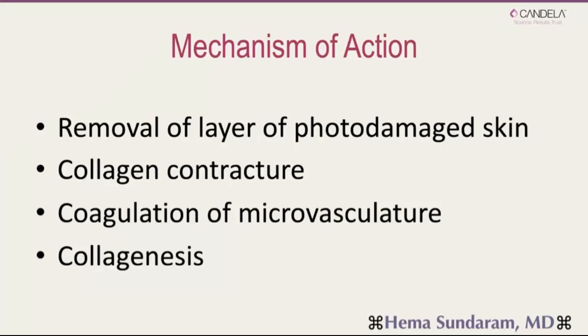during this procedure. And those of you who've used an erbium resurfacing laser will know it's different with an erbium laser to a CO2 laser like the core laser, where we really get this nice coagulation and control and hemostasis. And then, of course, we also have the potential for collagenesis, the formation of new collagen. And these days, we understand there's also the potential for elastogenesis, formation of new elastic tissue.